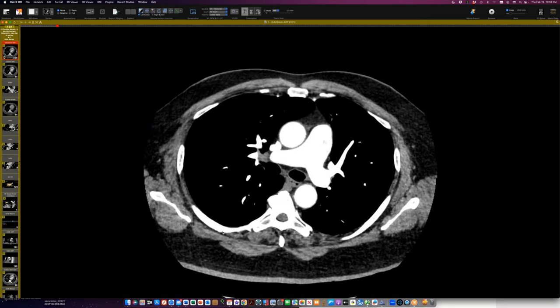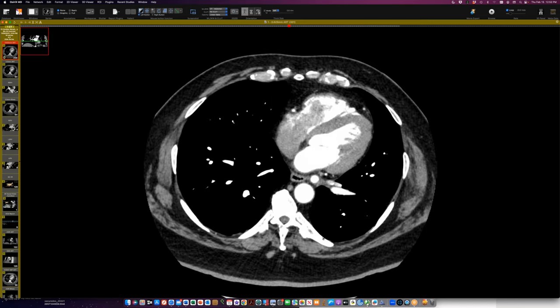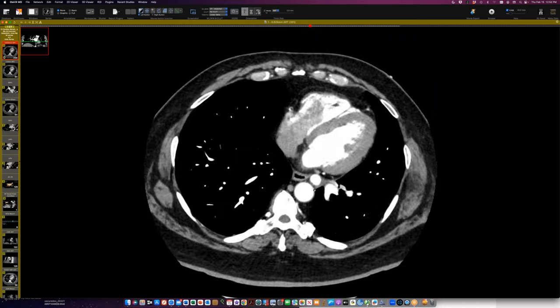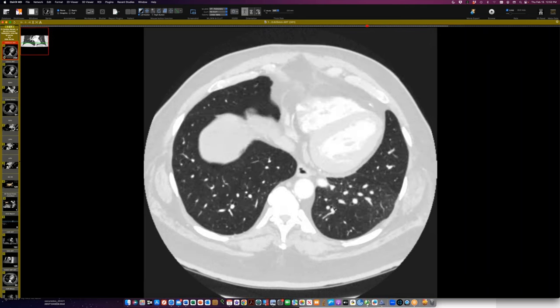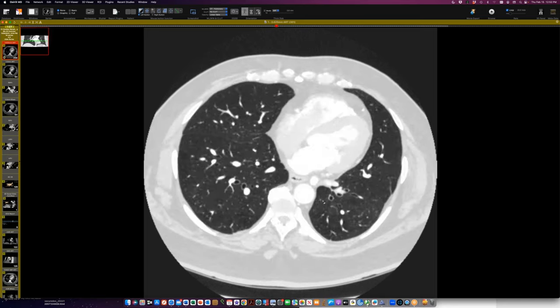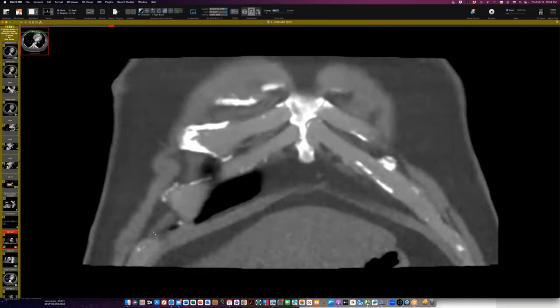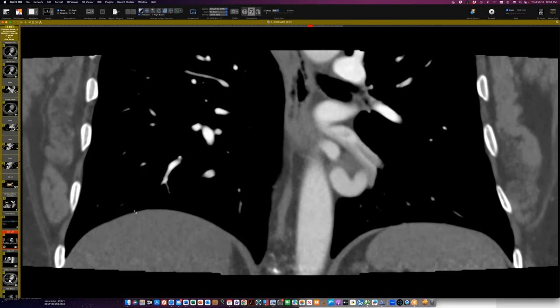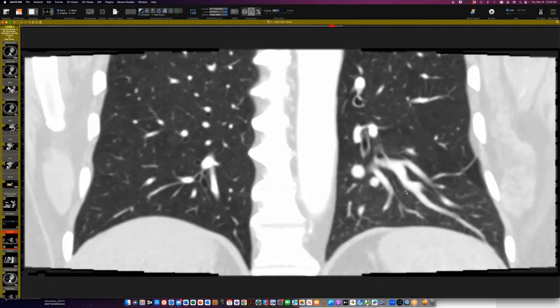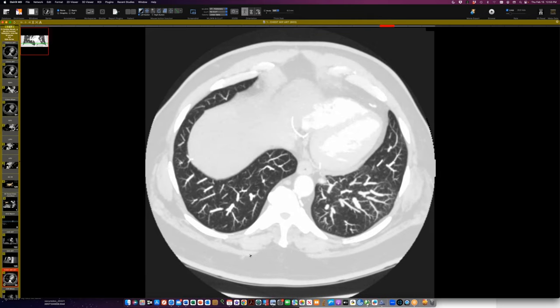I showed this case a couple of weeks ago — a case of systemic arterialization to the left lower lobe. There's a big artery coming off the aorta, winding around and supplying part of the left lower lobe. There's no sequestration in this case — we have normal airway communication with nice bronchi in that left lower lobe connecting to the central airway. Sequestration by definition requires removal from normal airway communication.